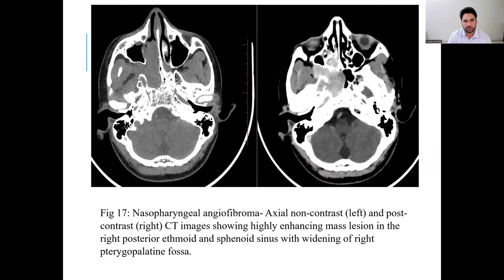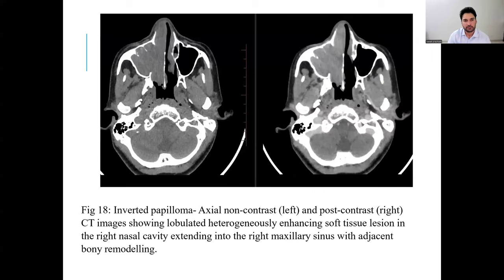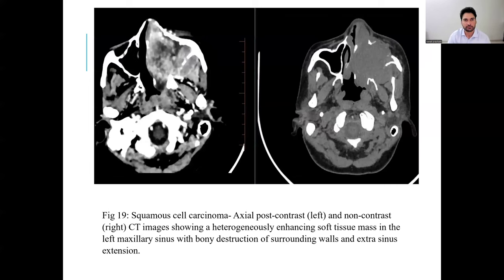In axial non-contrast on the left and post-contrast on the right, a nasopharyngeal angiofibroma is shown as a highly enhancing mass lesion in the right posterior ethmoid and sphenoid sinus with widening of the right pterygopalatine fossa. An inverted papilloma case shows axial non-contrast on the left and post-contrast on the right CT image, demonstrating a lobulated heterogeneous enhancing soft tissue lesion in the right nasal cavity expanding into the right maxillary sinus with adjacent bony remodeling.